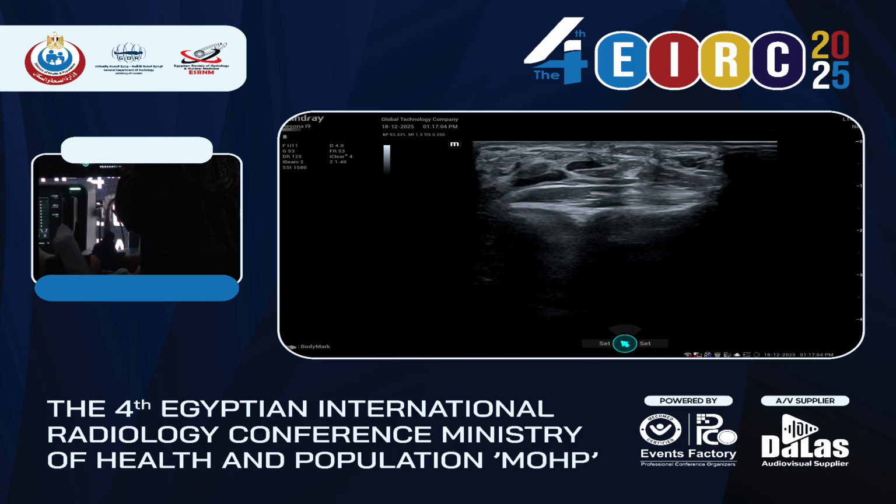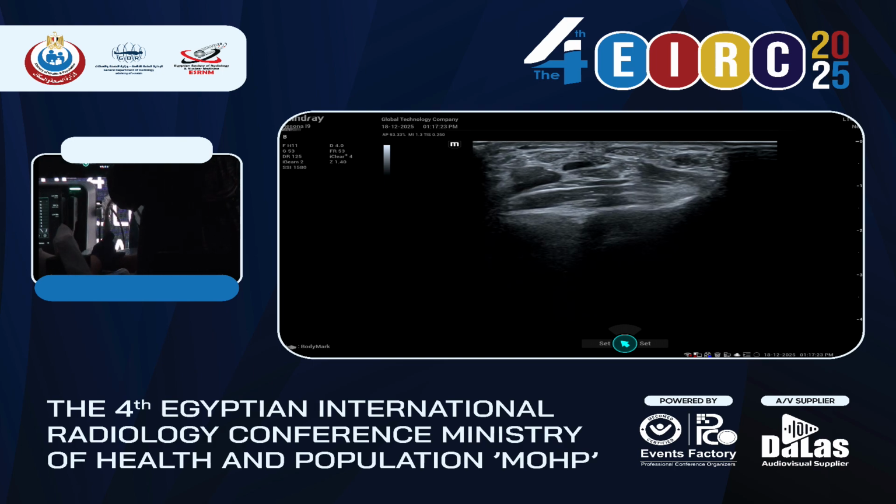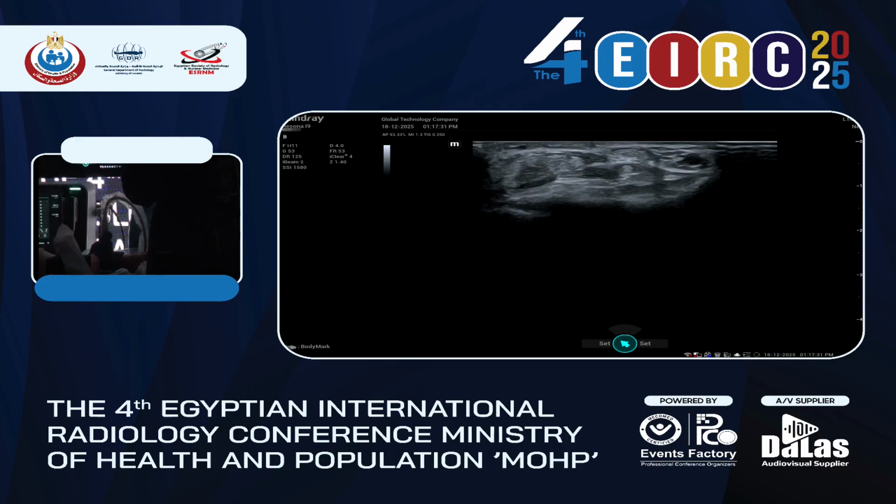The cross-sectional area trace, inside the echogenic epineurium. And we create the wrist to forearm ratio. So we create a ratio between them, and if the ratio is more than 1.4, the nerve at the wrist is enlarged. It is usually significant. You can also create the difference, so subtract one from the other, but it's not so much done in everyday practice. The wrist to forearm ratio is considered to be more accurate. So this is the way we do it.